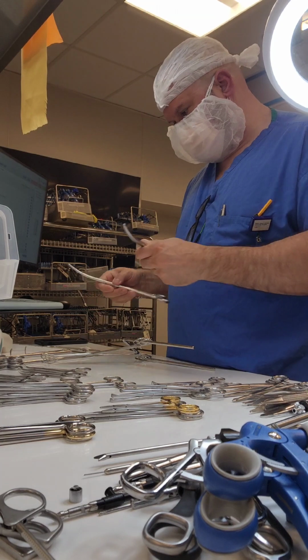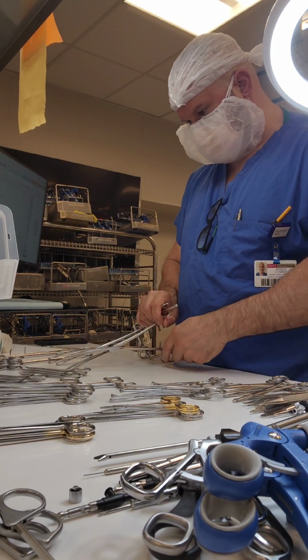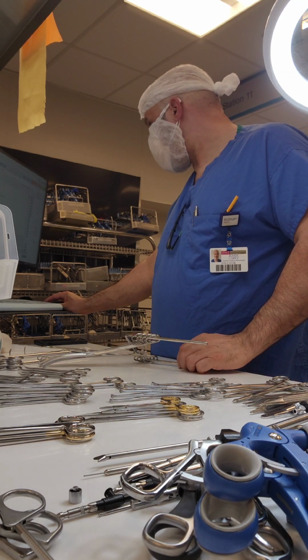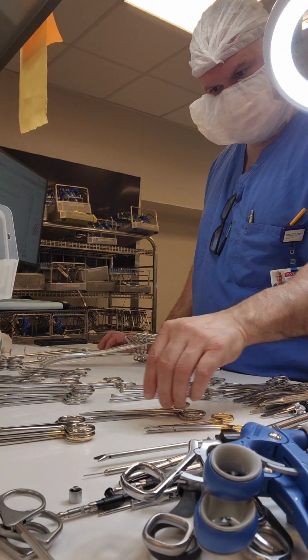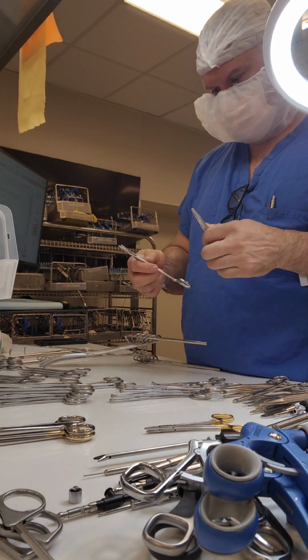I'm tap testing these. These are actually 10 inch Kellys. The tap test doesn't really apply there because you're never going to put it on one click. You're going to click it twice, maybe 3 times. So I found that doing a tap test on those larger, longer instruments really doesn't apply too much.